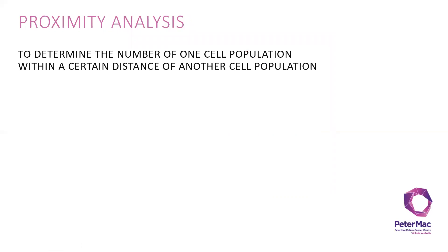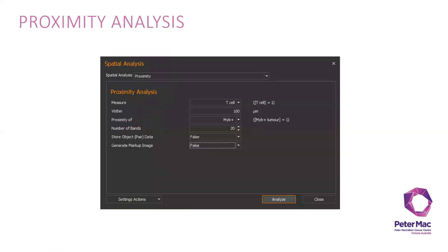For proximity analysis, it's to determine the number of one cell population within a certain distance of another cell population. With this example, I would like to measure T cells within 100 micron proximity of Myb-positive cells with a number of 20 bands, which gives me a 5 micron range.